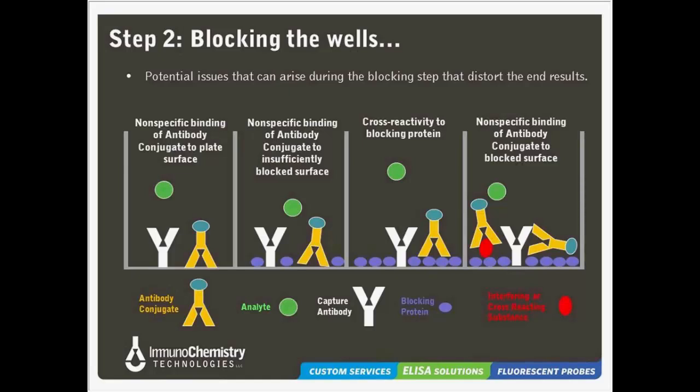Again, I encountered that in a prior job, and it took a long time to develop that assay because certain people had this IgM phenomenon, and we know it is because I actually did some experiments where I took a rabbit anti-human IgM and incubated it with the person's samples, and then the problem went away. So I know that it's IgM based, and that's as much as I can tell you at this point.